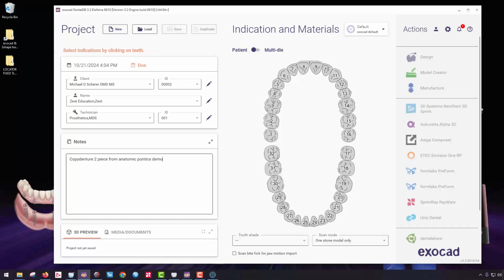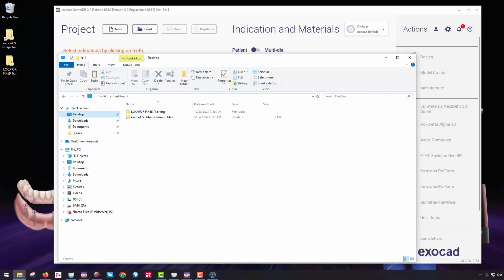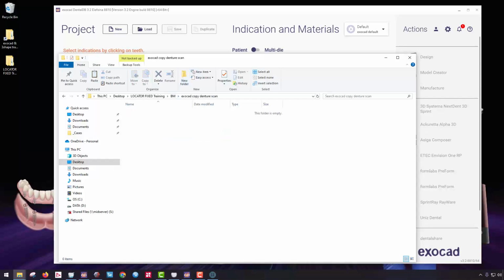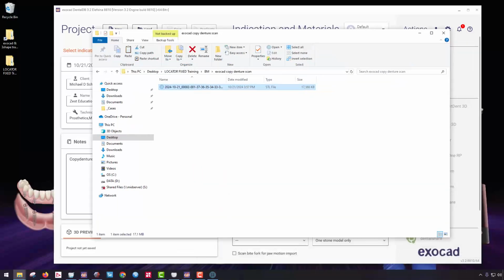And what I need to do is tell the software what I'm going to do. So I'm going to bring up that STL file that's right in here. And just for good measure, I'm going to drop it into a folder on my desktop. So bring it right here. Let's do exocad copy denture scan. And then just dump it into that folder. So literally I've just copied from the exocad folder into this folder.